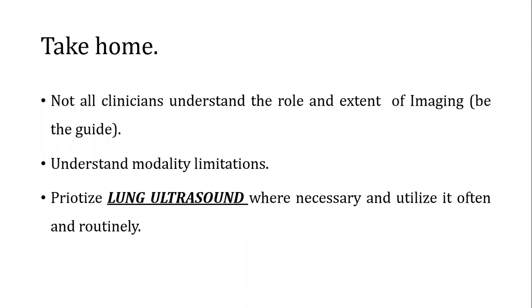But the common mistake is the chest X-ray will say maybe pleural effusion. It is difficult to tell the difference between pleural effusion and an empyema on a chest X-ray. But I can comfortably tell you on lung ultrasound, it's very easy.